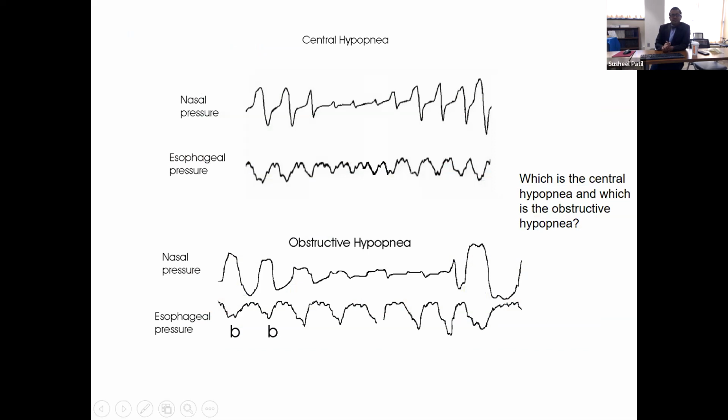So this is just an older stylized example. If you actually did esophageal pressure monitoring, this is what you would see. But in this case, on the example down below, now inspiration is up, expiration is on the bottom here. But with each esophageal effort, you can see that there's flattening of the inspiratory waveform. And the fact that there's effort tells you that this is obstruction, along with that flattening.